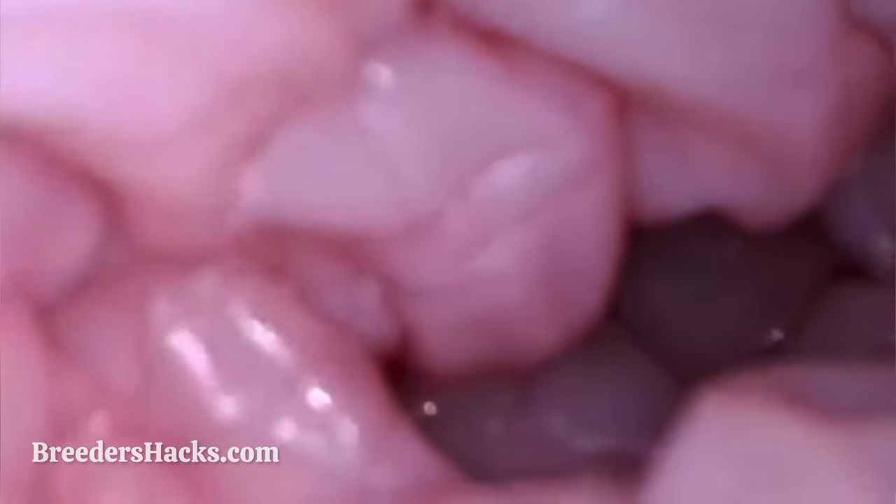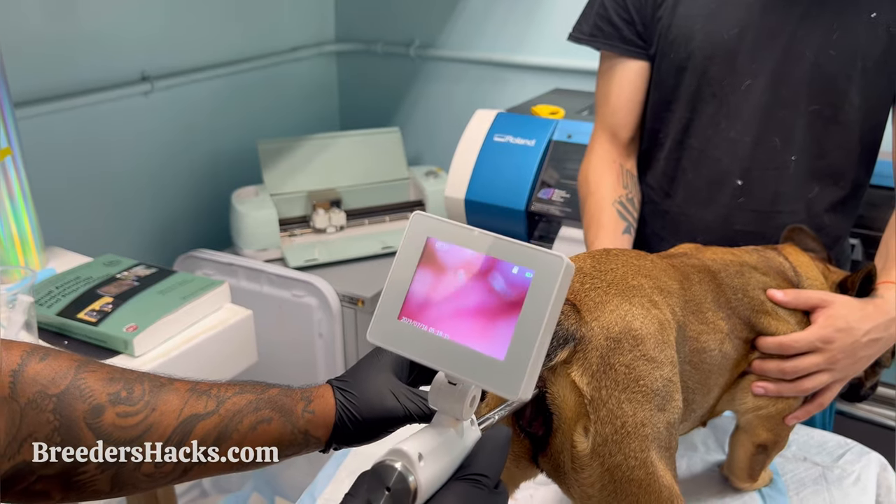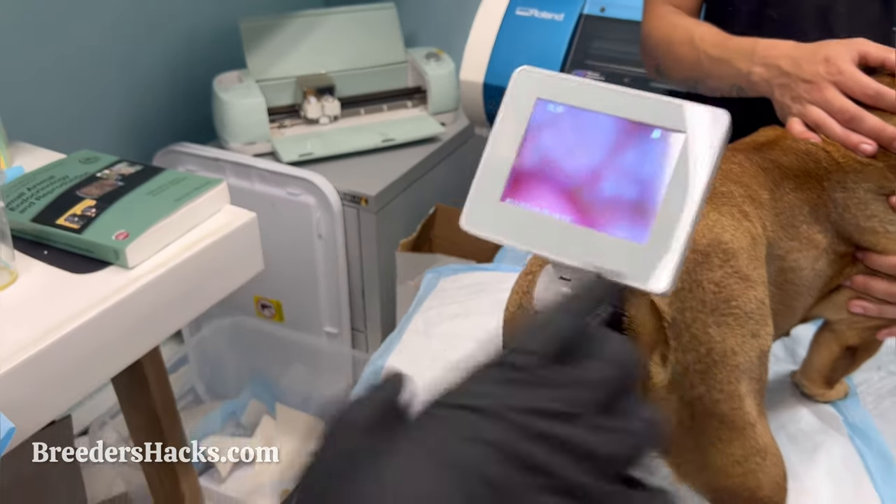Once you get to what looks like the opening of a mouth — gummy and wavy like a mouth — that's the cervix. We want to inseminate the semen right past that, putting it past the cervix right into the uterus. So as you can see, that's basically where we got to. You can visually see just like you're doing an AI, and once you've passed the cervix you want to go as far as you can, a little bit past it, to put the semen right into the uterus — bypassing the cervix opening and going right in.